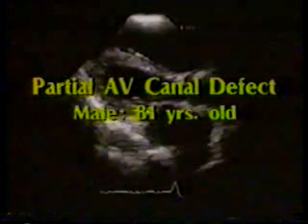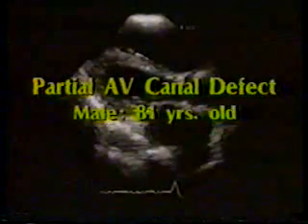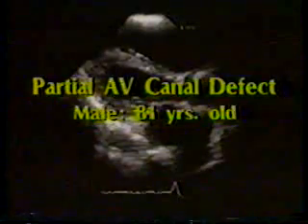This is the 2D echo examination of an 81-year-old patient who is the oldest patient with partial atrioventricular canal defect that we have seen. In this long axis view, note that the right ventricular cavity is markedly dilated, left ventricular dimensions are normal, the mitral apparatus is somewhat unusually oriented into the left ventricle, and this will be better appreciated in real time. The left ventricular outflow tract is normal and left atrium is moderately enlarged.